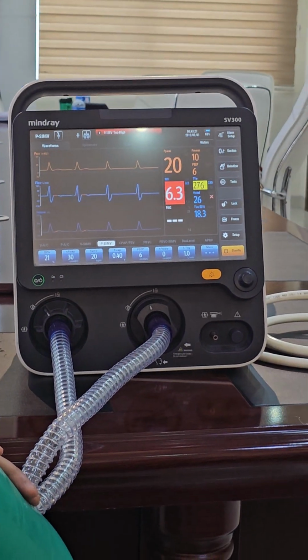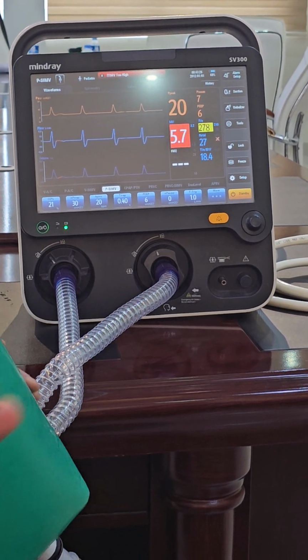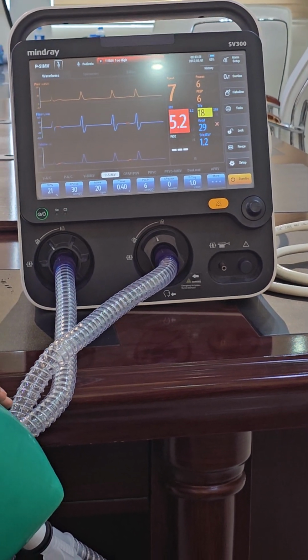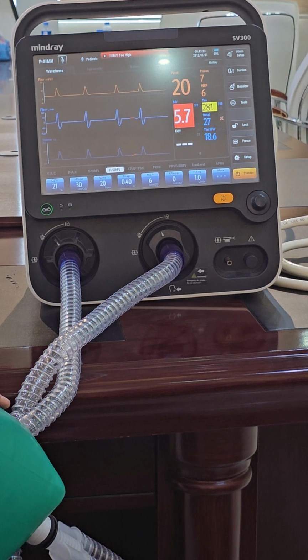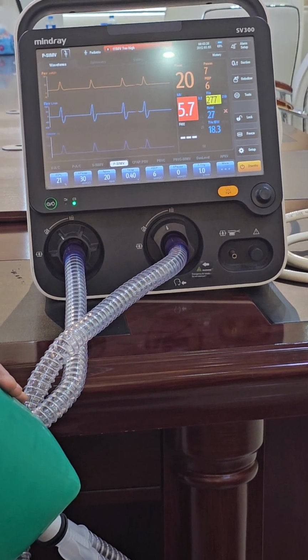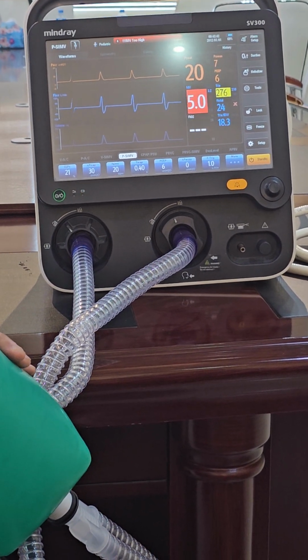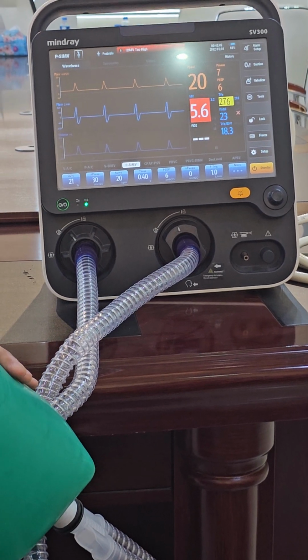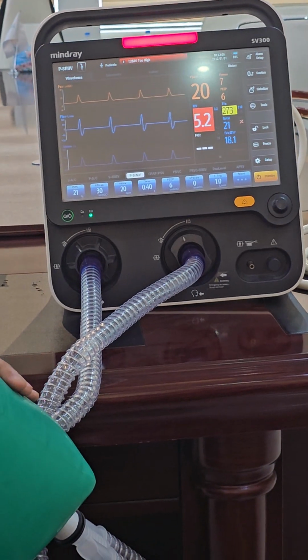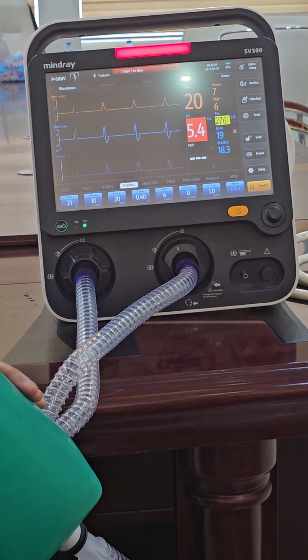If you give it, what will happen? Either you make an accident, or you stop. You have to stop aside and stop driving. Okay? So the baby will either stop breathing, or it will be what? Will be exhausted. And that's the PSV. So we use it only when the patient is capable, not sedated, and for a certain period of time. We cannot give it more than 24, for example, 24, 48, depends on the patient. But it should not be for long.